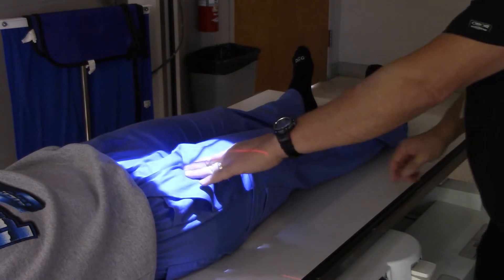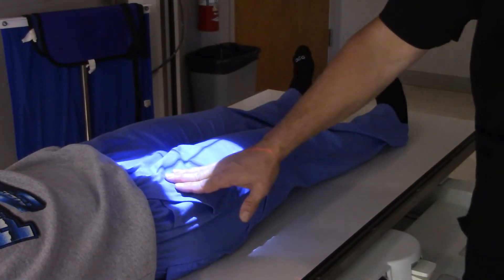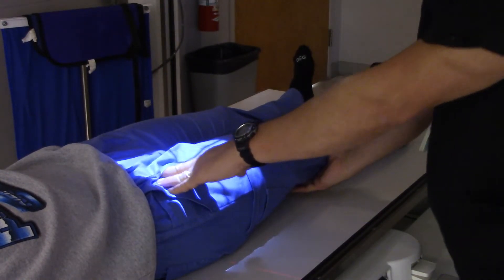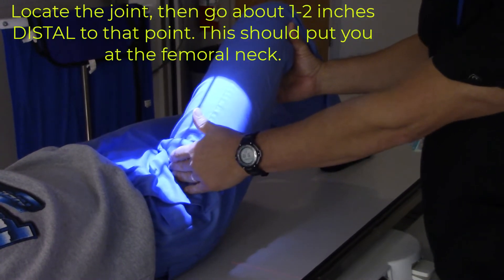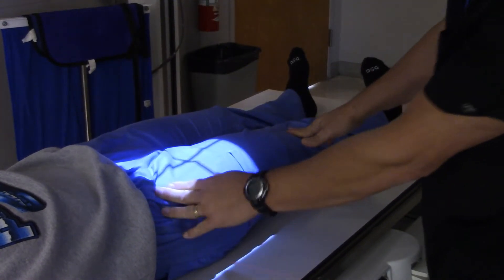What if my patient is too big and I can't find any landmarks? All is not lost. What I can do is bend this patient's knee up, and right there is where her hip joint is going to be. Okay ma'am, just relax it back now. So I'm right on it — perfect.